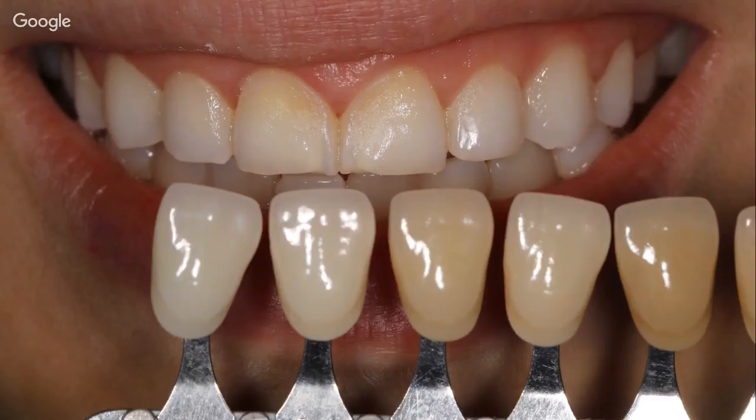I start with a preoperative shade registration. As you can see in this picture, I said I will go off topic during the presentation, and this is one of the times where I'll go off topic. You have to appreciate the power of good dental photography and the things that you are able to see when you perform this kind of photography.